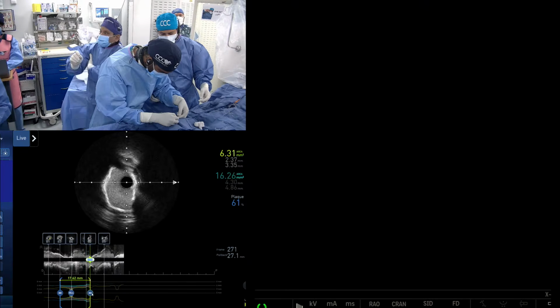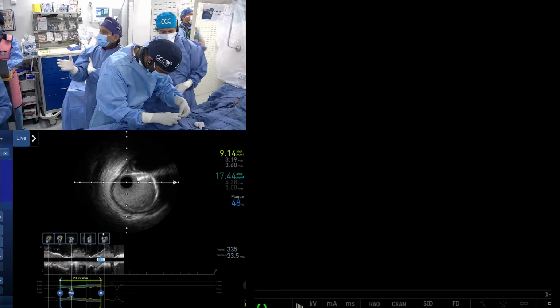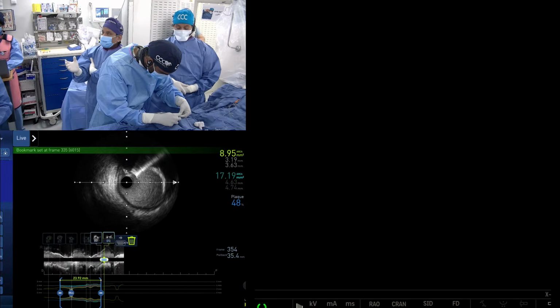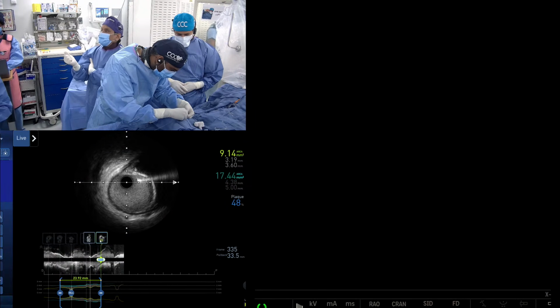If you have a very short left main, you put a very short balloon, because it's 6 millimeter with no shoulder, so it's good. But many times we put an 8 millimeter stent in the distal left main, so your regular 8 millimeter balloon works quite well. Therefore we don't routinely use the POT balloon.